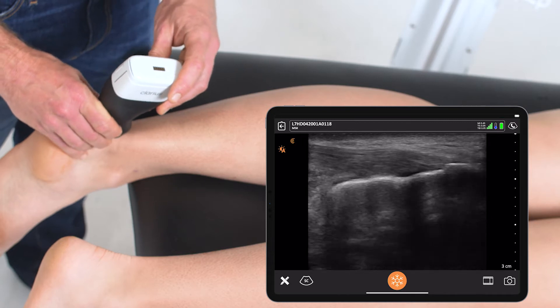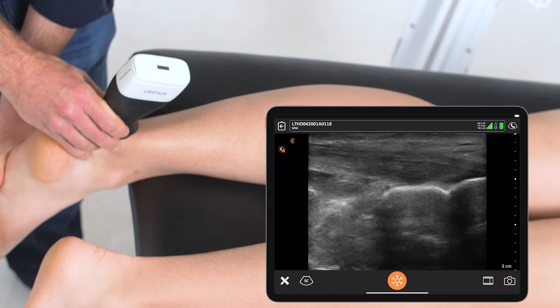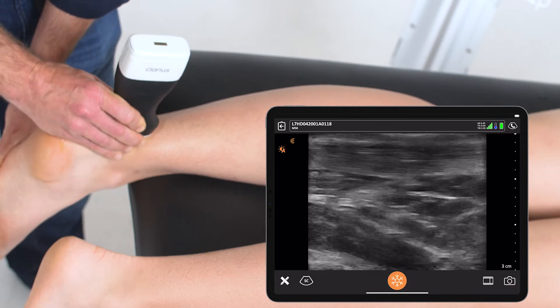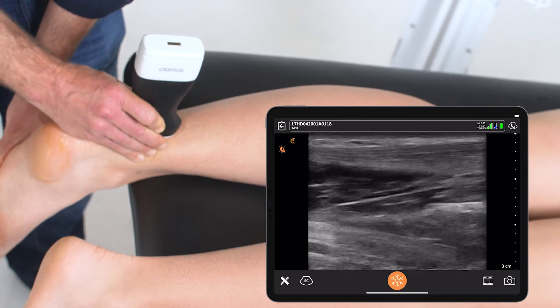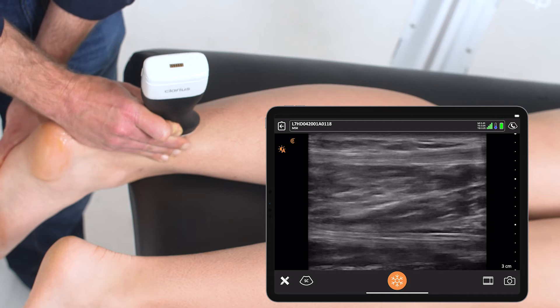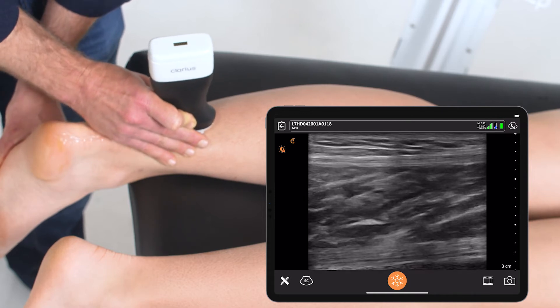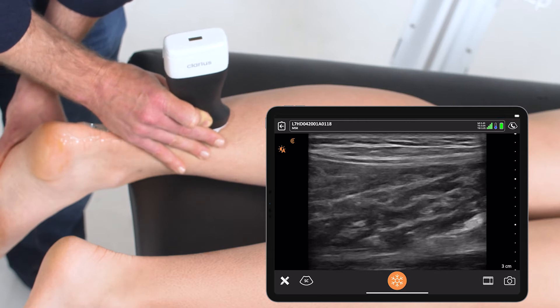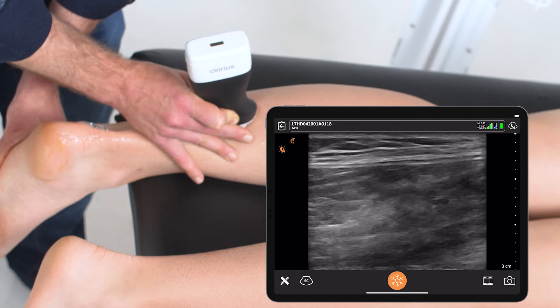From here, I like to proceed proximally up the leg, identifying that tendon along its length all the way up through its mid-span and up into the gastrocnemius. Tears of the gastroc can be seen up here in its distal aspect, or even further up into the posterior calf area.